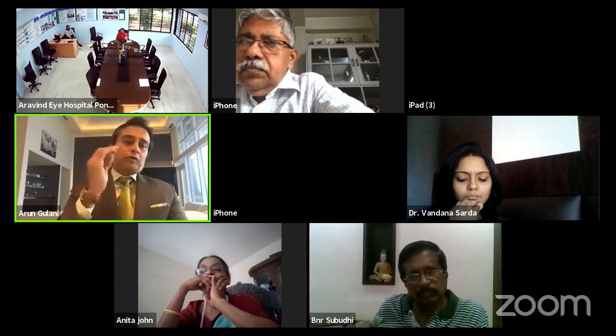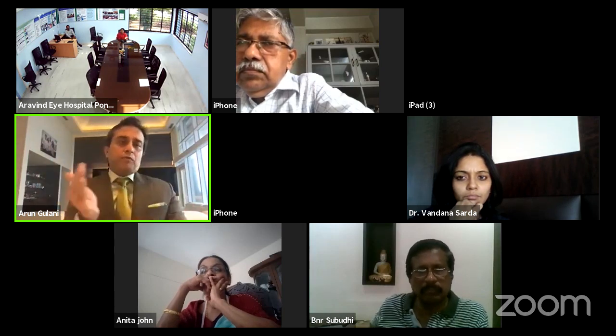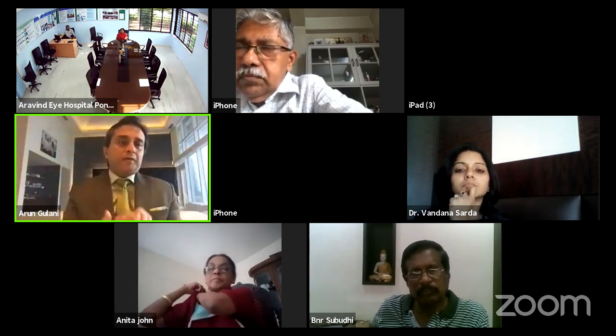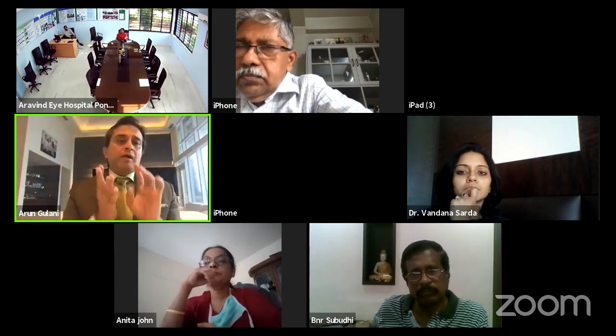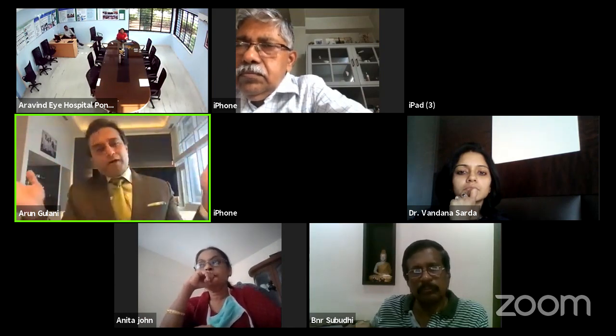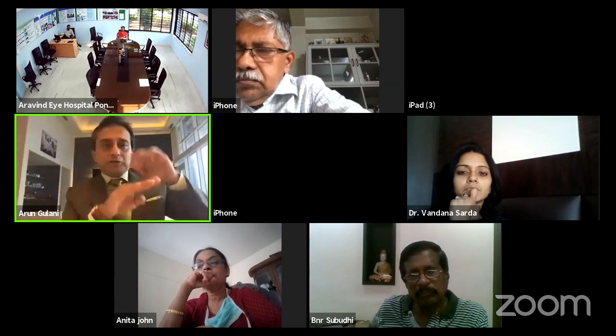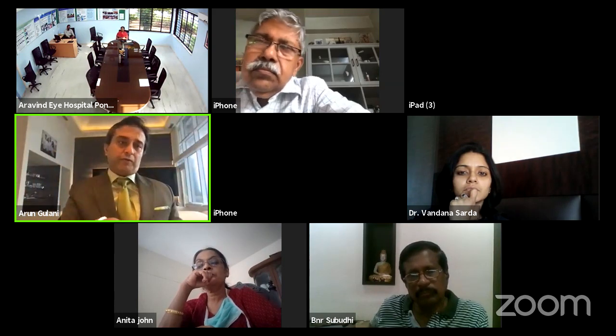Very rarely will I use cautery if I do want some area like in recurrence and stuff, and I'm seeing a large blood vessel going around somewhere. But I believe, having seen patients that come to us, extensive cautery, a lot of mitomycin spread everywhere. I mean, when you're using mitomycin, use it with a Weck-Cel, like 5 pieces, between the conjunctiva and Tenon's. I don't let it hit the sclera, if you saw in the video.